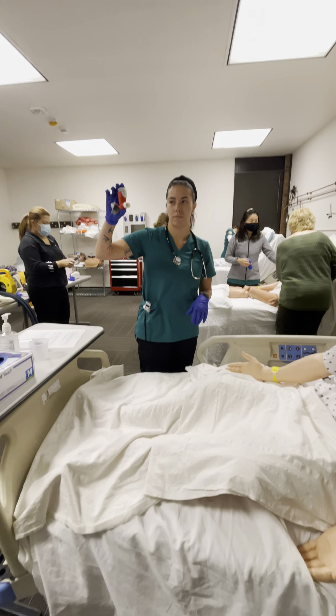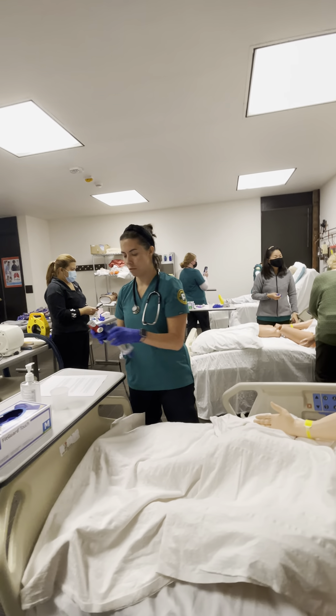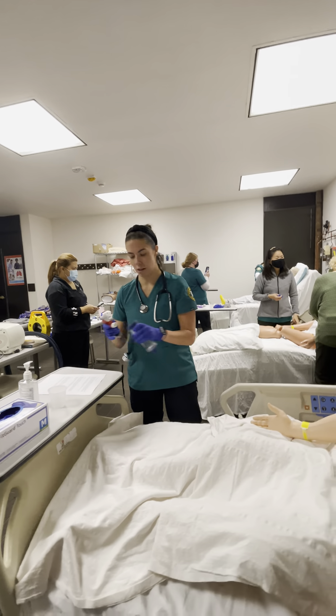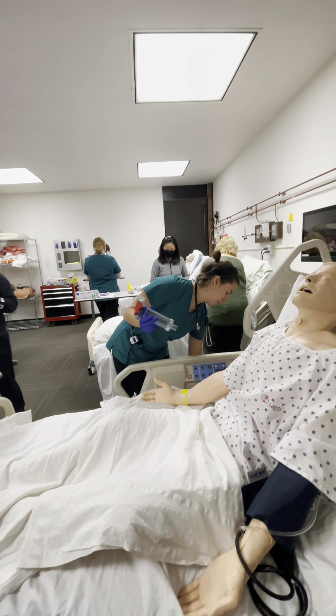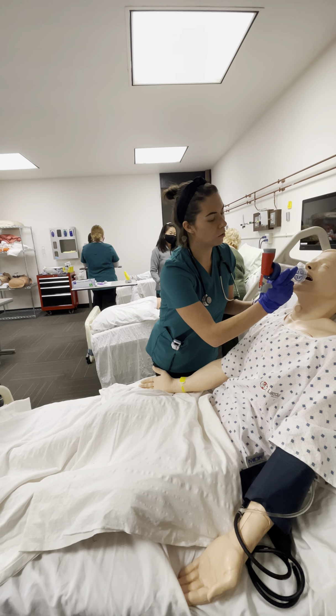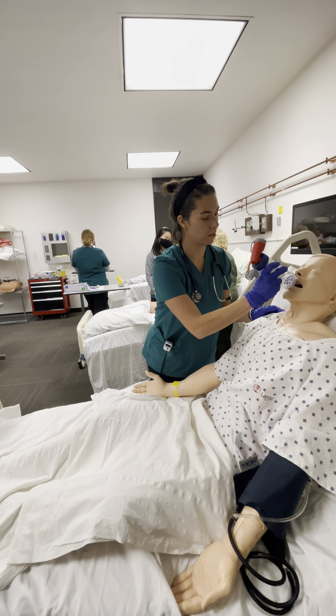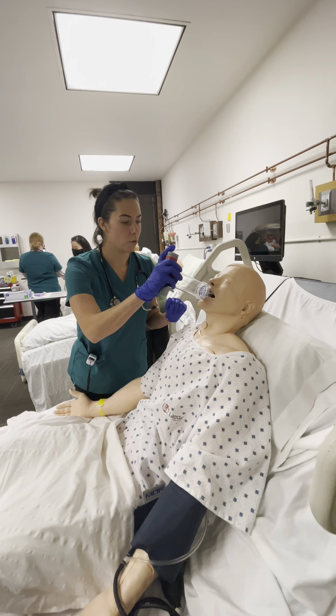Go ahead and press down on the canister and let out a couple of puffs. Once you're done with that, you can go ahead and put it into the holding chamber. Take off the cap. We're going to form a tight seal around the holding chamber's mouthpiece.